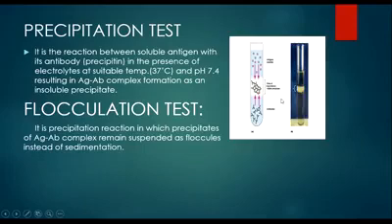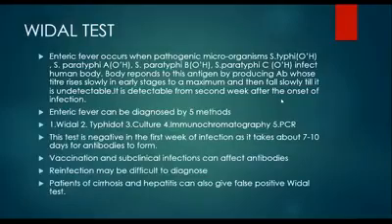Then the flocculation test. It is a precipitation reaction in which precipitates of the antigen-antibody complex remain suspended as floccules instead of sedimentation. Now coming to the main topic, Widal test. This is a diagnostic test for typhoid fever, which has some other tests as well. For example, Typhidot, culture, where blood culture is the gold standard, immunochromatography, and PCR.